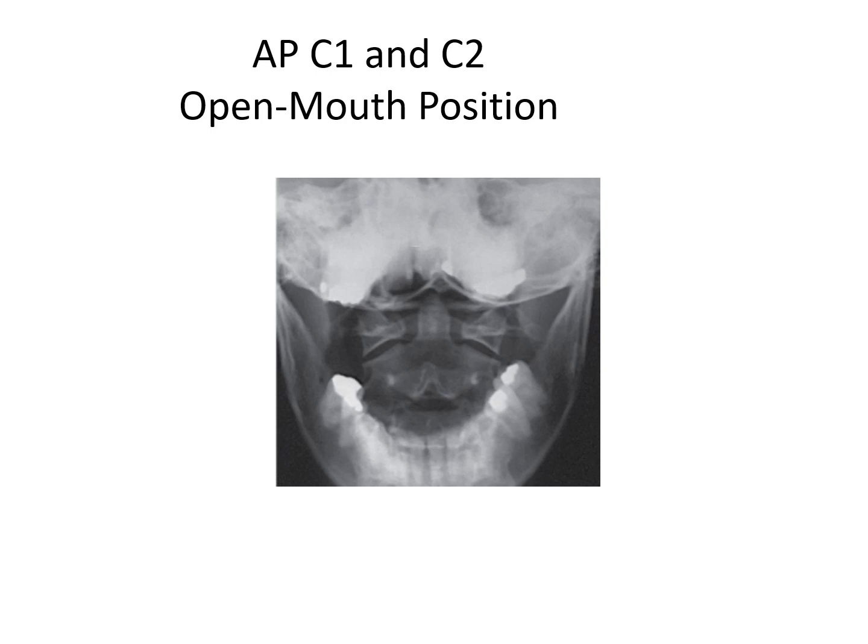So again, let's spot some of the structures. You can actually see the base of the skull. Remember the curve with a single mountain peak? That's right behind the very tip of the top of the dens. The mountain peak is intersecting one of the front teeth. So you see the teeth of the upper jaw in line with the base of the skull, perfectly superimposed, and the dens and the lateral masses right below that level.